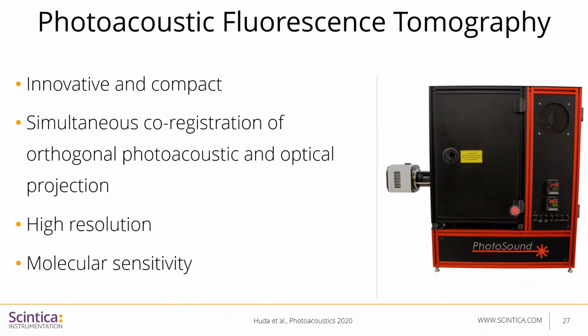As you can see in this image, this is how the machine looks. It simultaneously co-registers orthogonal photoacoustic and optical projections. It utilizes high spatial resolution from photoacoustic imaging and superior molecular sensitivity from fluorescence tomography, all of this on one platform.